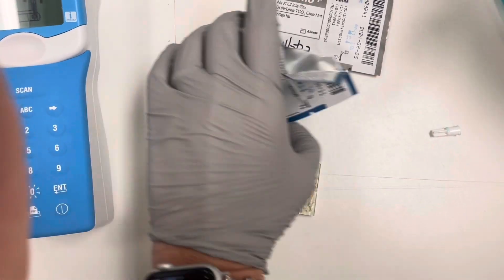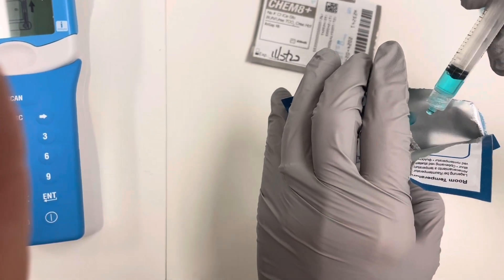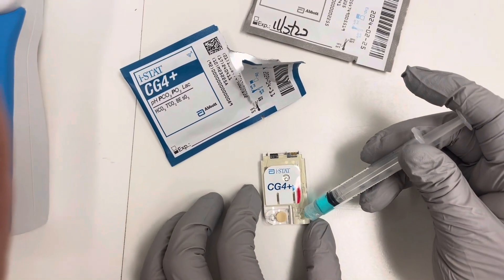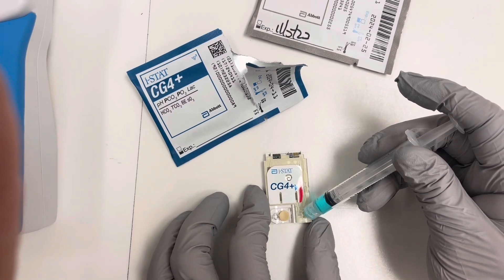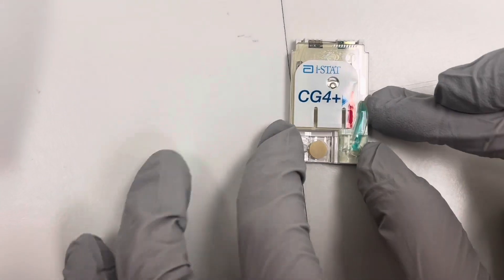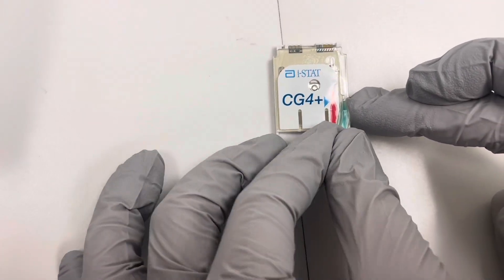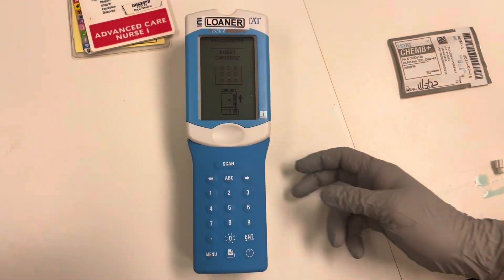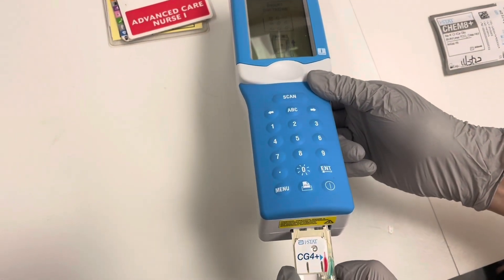We are going to expel a couple of drops to remove the air bubbles. We are going to tilt it to the side, not inside the hole, and fill it up to the hole. There it is adequately filled. We are going to pull over that clamp and hear it snap, and then we are going to insert it into the iStat.